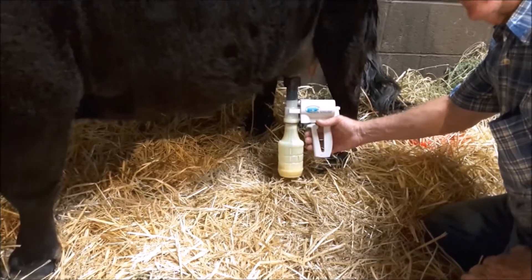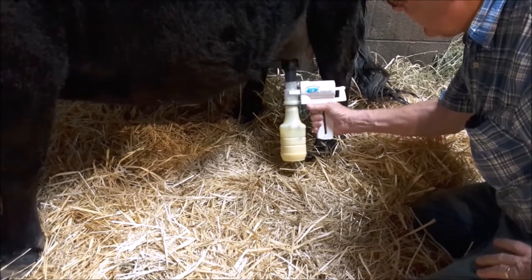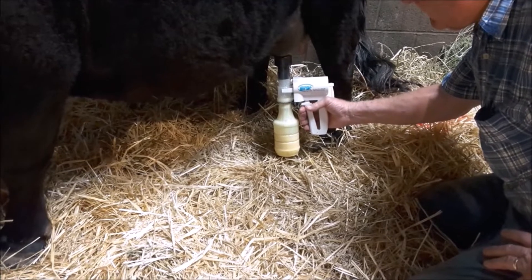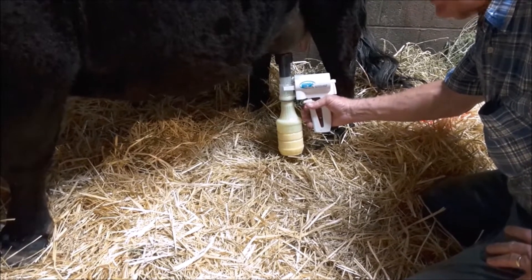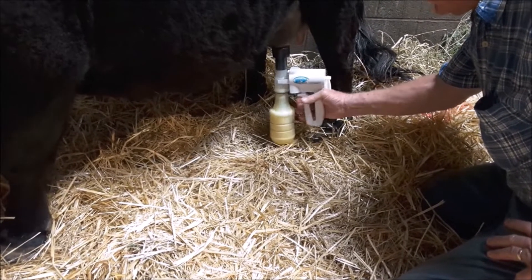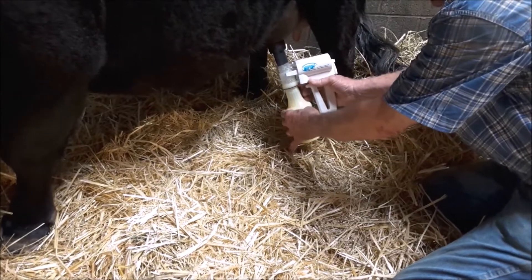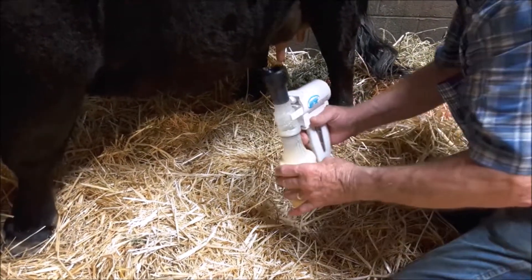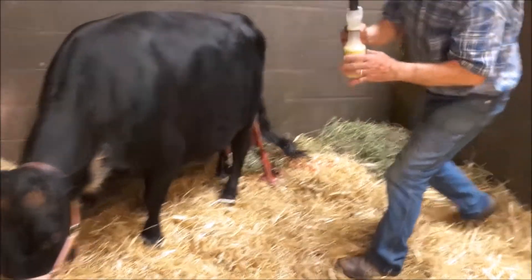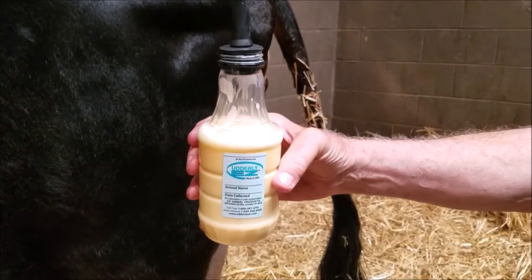Once you get the pumping and the colostrum flow started, quit pumping, then just slow down and pick it up again. You can see how fast that's filling — probably around 10 seconds or less and we've got 18 ounces of colostrum. I tip the bottle back, it comes right off the teat, and I'll give this baby another shot of colostrum.